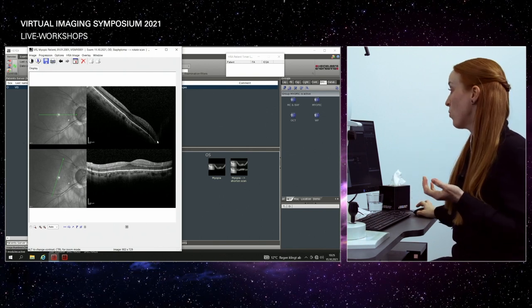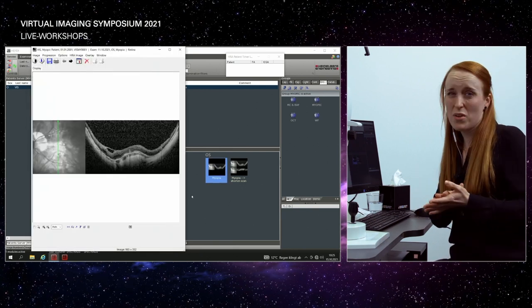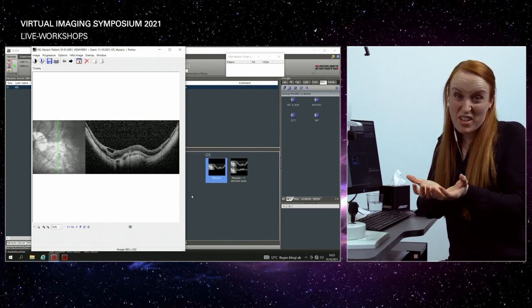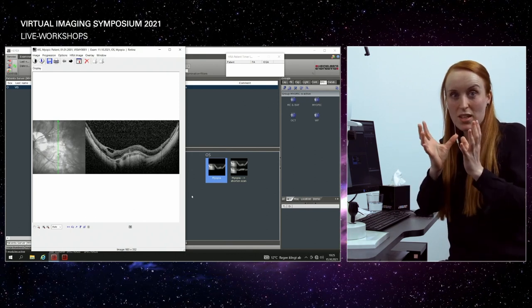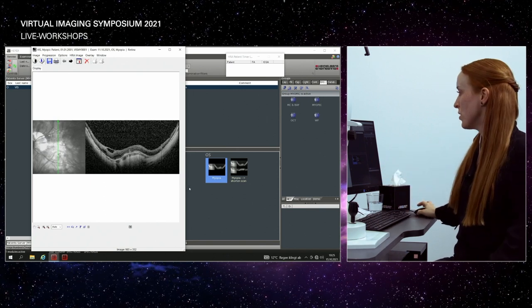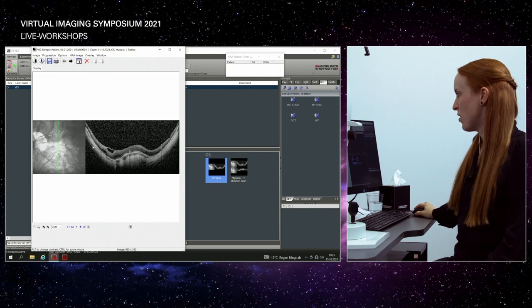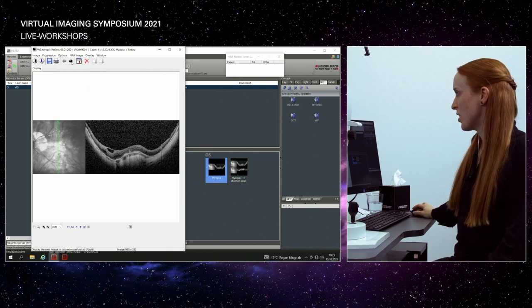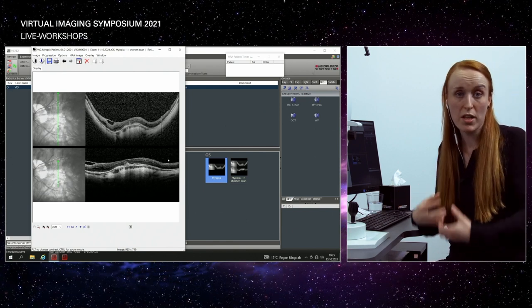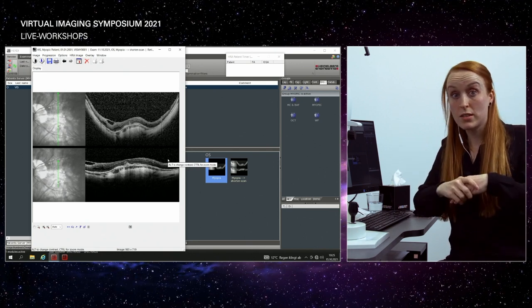What else can happen in myopic patients is this, okay? There you have this really spheric shape, kind of, in the scan length you're using right now. And what you can do is to just avoid imaging this area, and you can just shorten your scan to get the focus on that information that matters for that patient in that moment without having it that tilted, okay?